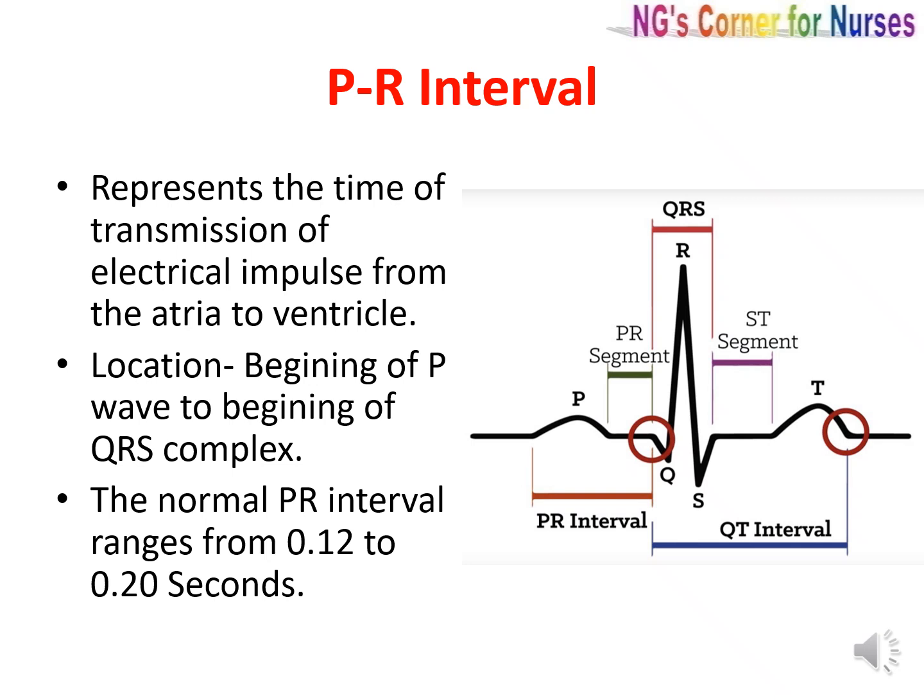There may be abnormality in PR interval. Maybe short interval which indicates junctional arrhythmias or pre-excitation syndrome, and prolonged PR interval may represent heart block or conduction delay due to digoxin toxicity or slowing related to ischemia or conduction tissue disease.